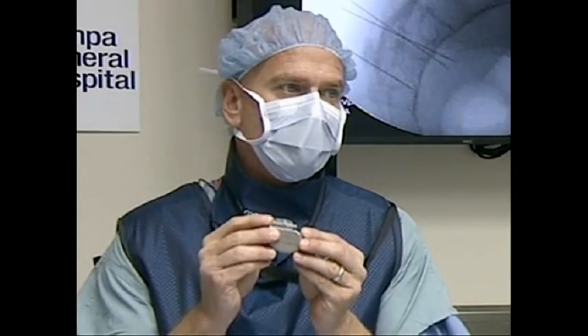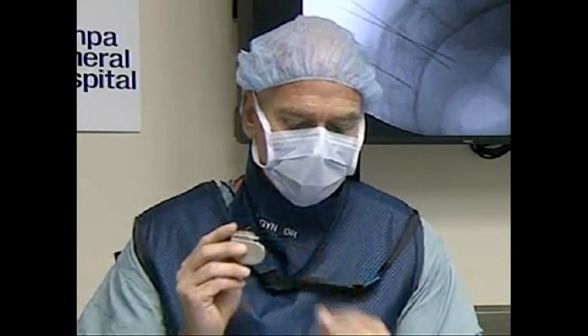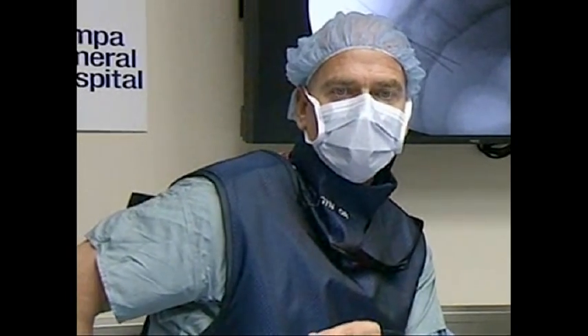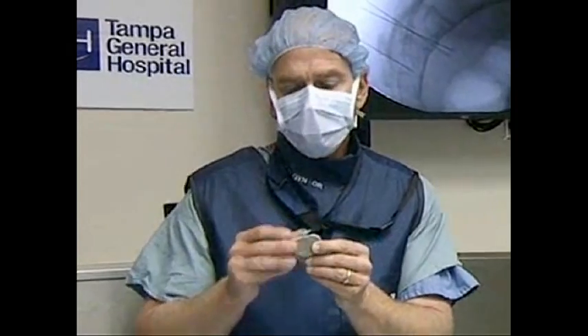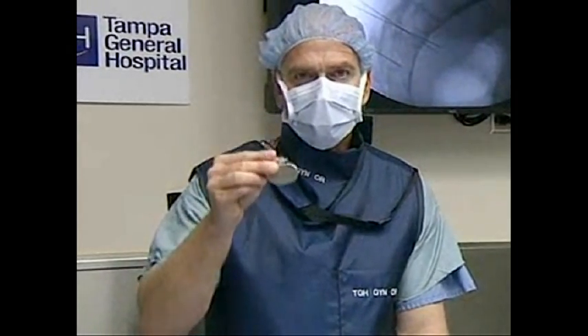The battery on these actually lasts five to seven years, so most patients won't have to have any type of change. When they do need a change, it's done by opening a small incision where the battery is placed. The battery is placed on the side of your buttocks below the fat — it's difficult to tell or feel it, but you know the proper position and that's how you adjust it. None of this is on the outside; these are all implanted components.